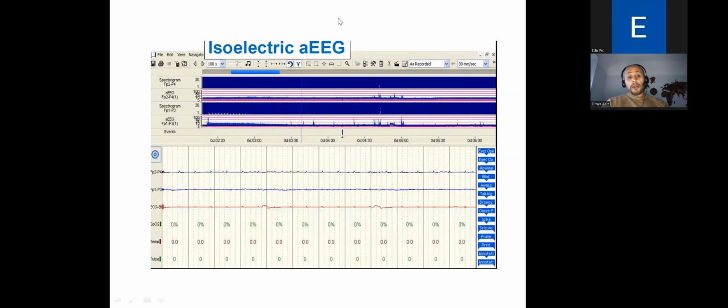Most of these patients are essentially in a coma because they're on a lot of sedation and muscle relaxant. No fluctuations, brain death, sedation. Yeah, excellent. So it shows that the electrical activity in the brain is extremely flat. If you look at the top 2 lines, they're extremely flat and you can hardly see any red in them at all.